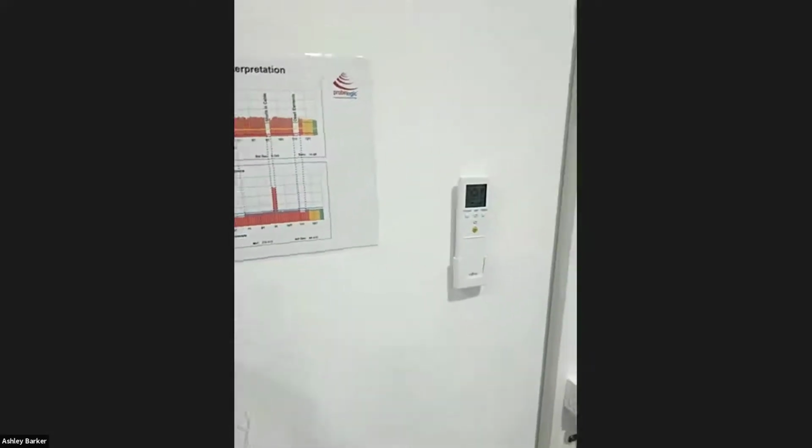So hopefully that's given some useful information. Like I said, I have always worried about the transducer end. I think I'm going to worry about the connector end a little bit more too. But it's fascinating to see. I've seen the strain relief go quite commonly, but some of those other ones are quite spectacular. And I'm sure it's just run of the mill for you. But it's important to keep your probes nice so that we're being safe for our patients. Safe for your patients. And also, if your probes have got a whole bunch of elements down, you're just making your life hard. It's going to take longer to get the scans that you need, and time is money. So you're better off just getting it sorted.